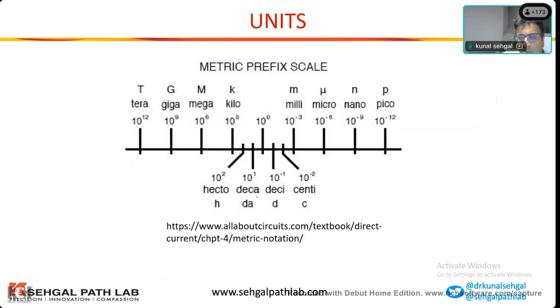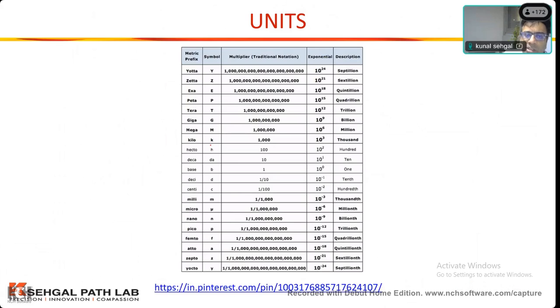This is just given to you for reference, and this goes back to the early days where you recognize units. What is milli? What is micro? What is nano? What is pico? Nano is 9, everybody knows. Pico is 12. Femto, F, is 15. So that is femtograms or femtoliters, depending upon what you're measuring. One should understand the units. You could take help of the scale. There is no harm in keeping the scale next to you. As said, we are looking at really small size particles, so micro, pico, and femto.